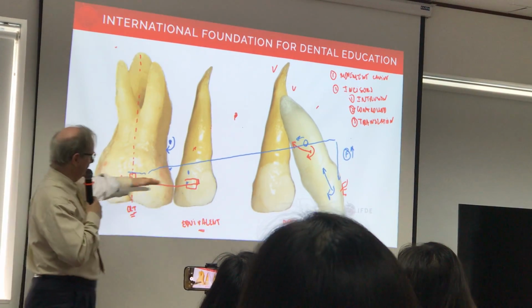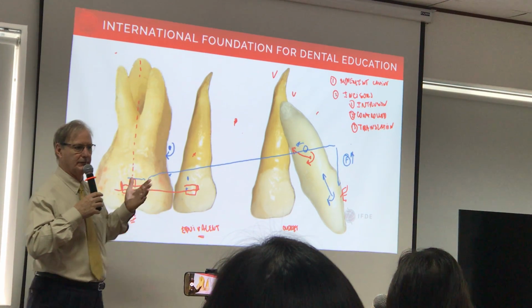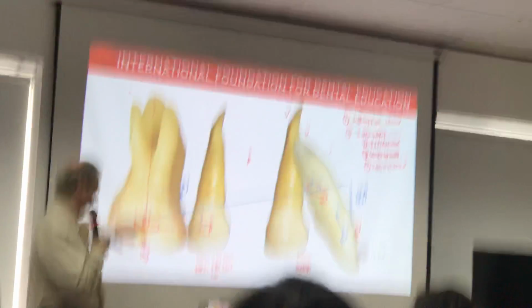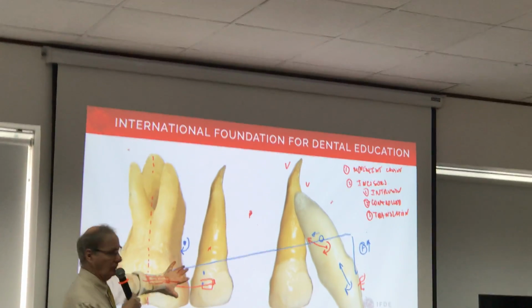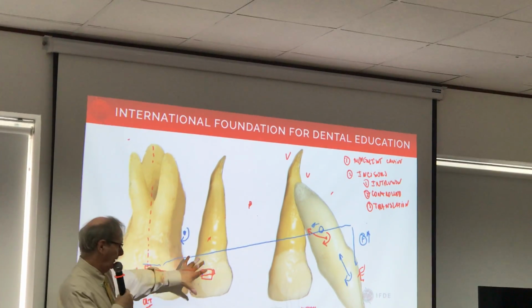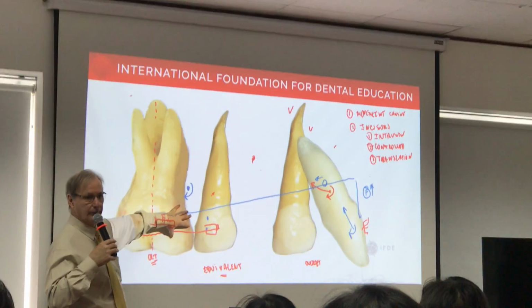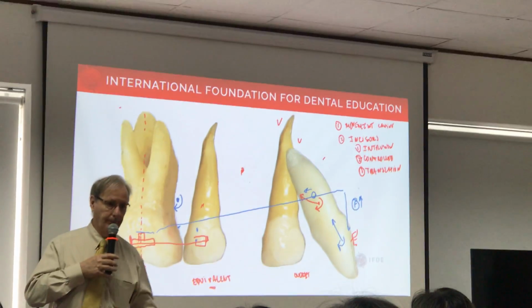Which tends to drive these teeth back and down a little bit, which is cool because then you're actually distalizing the molars and you keep them, they're not going forward, they're not tipping forward, they're actually kind of staying where they are. And if you don't put too much force, the moment is not too big and you will get probably a bit of rotation, but that can help opening of the bite. So this is called anchorage control.